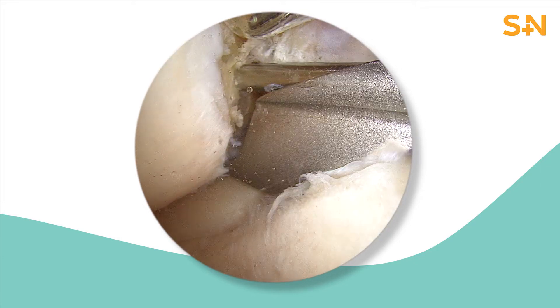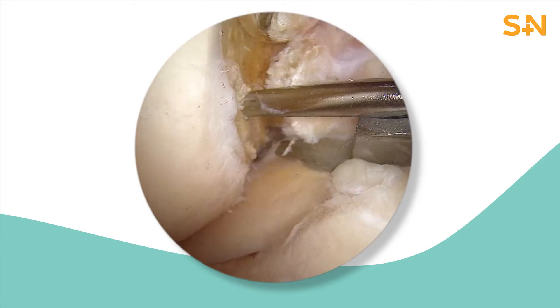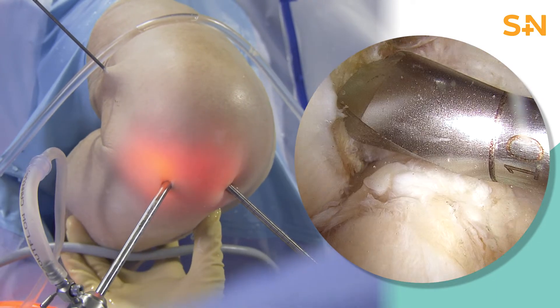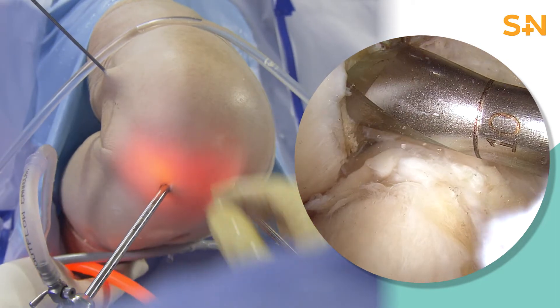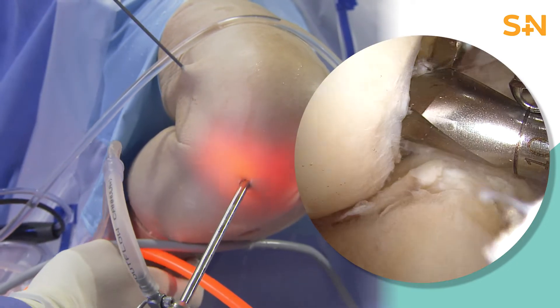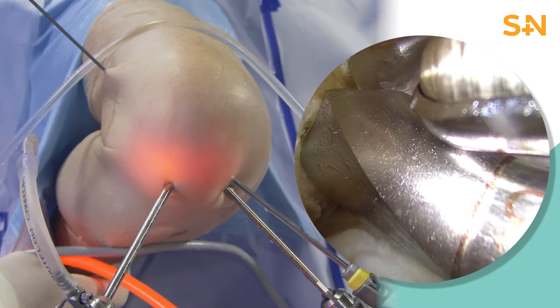Ensuring that at least 2 mm of adequate back wall is preserved from the posterior articular cartilage. The knee is then flexed to 90 degrees, and the guide pin is drilled from inside out using the angled endo-femoral guide. The Director single fluted 10 mm reamer is used to a depth of approximately 20 mm. This single fluted reamer allows for a safe passage into the notch. Always ensure the blade is pointed vertical to avoid any cartilage damage to the medial femoral condyle upon entry and exit.